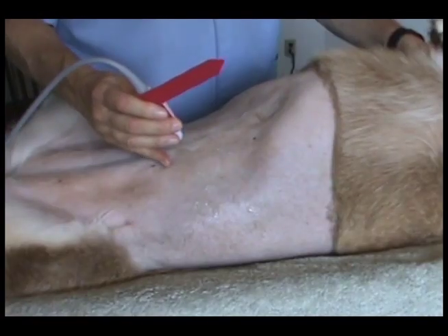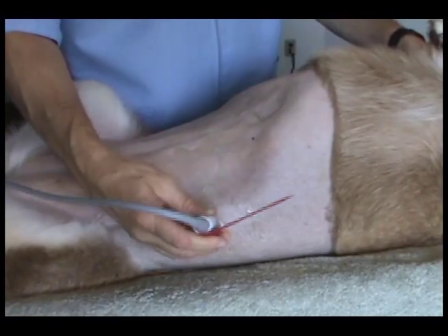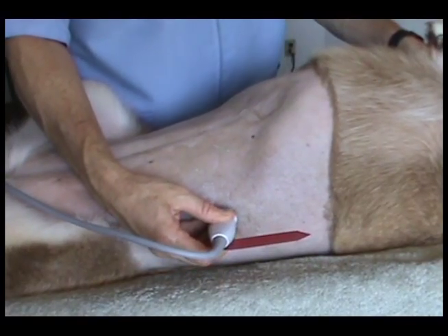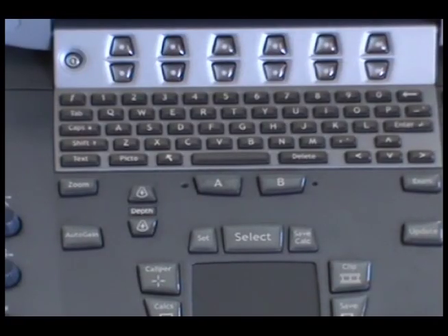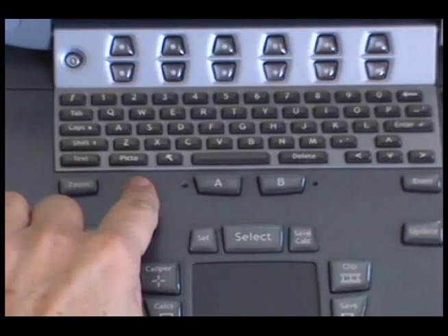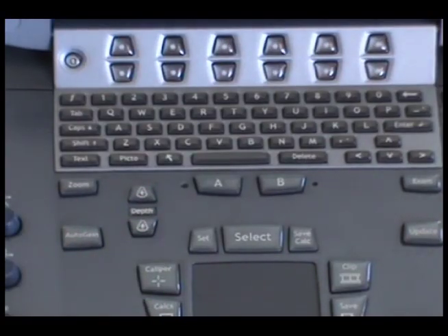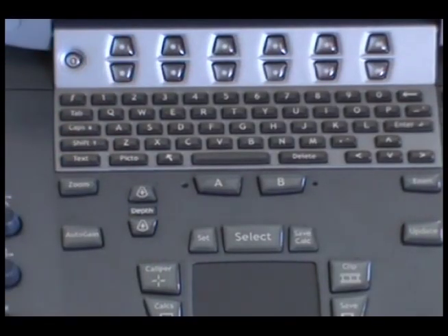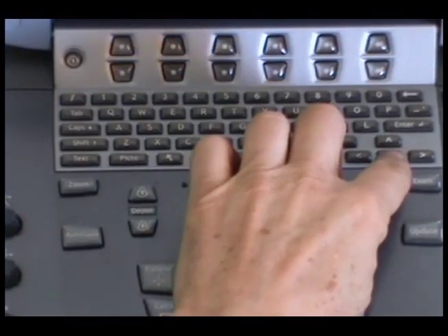This is best accomplished by holding the transducer perpendicular to the patient's body and the organ of interest. Adjust depth to fill the ultrasound screen with the organ of interest if possible. If needed, adjust transducer frequency for the current depth. Adjust gain for the best image. And adjust focal points to the bottom of the organ of interest.